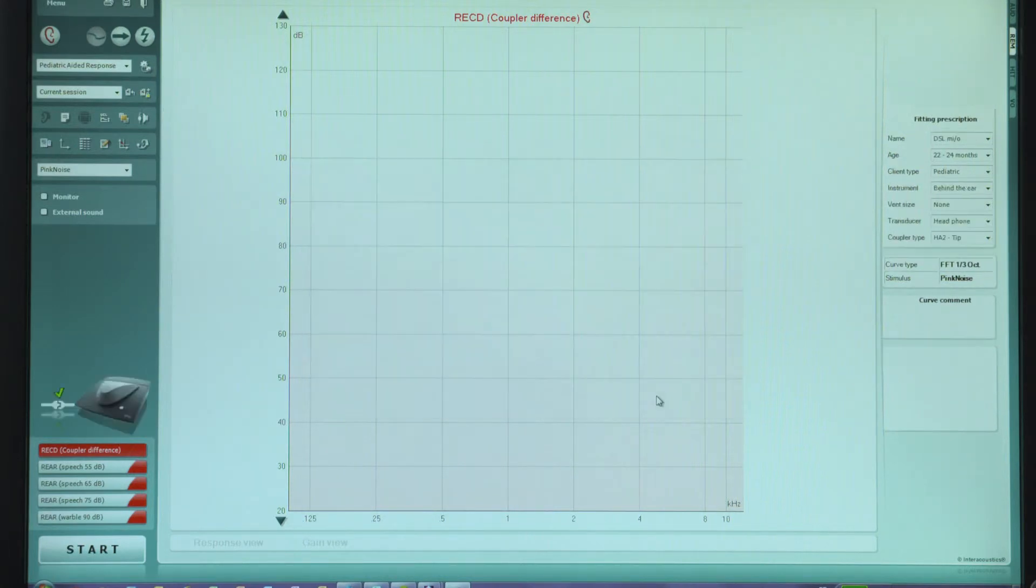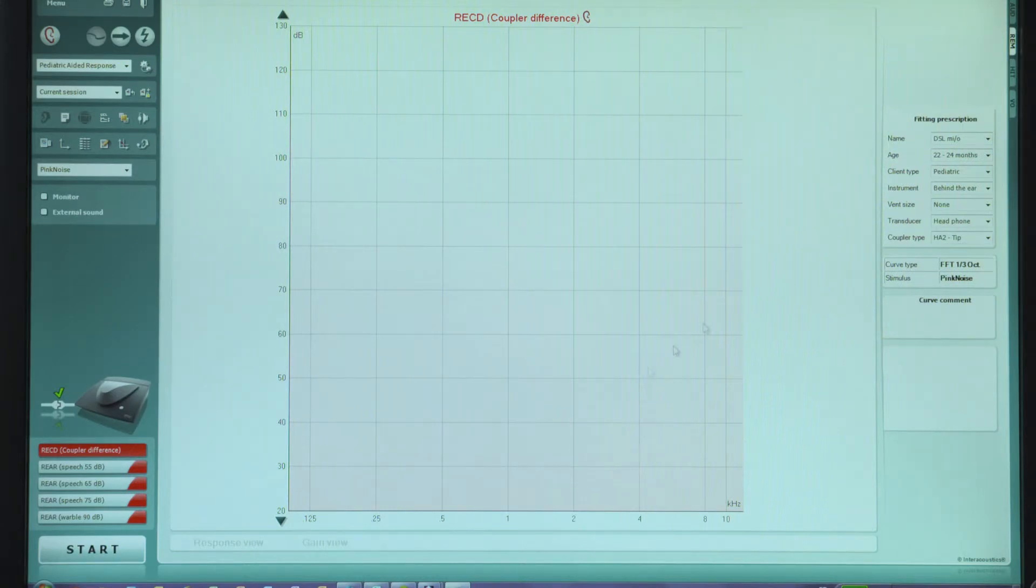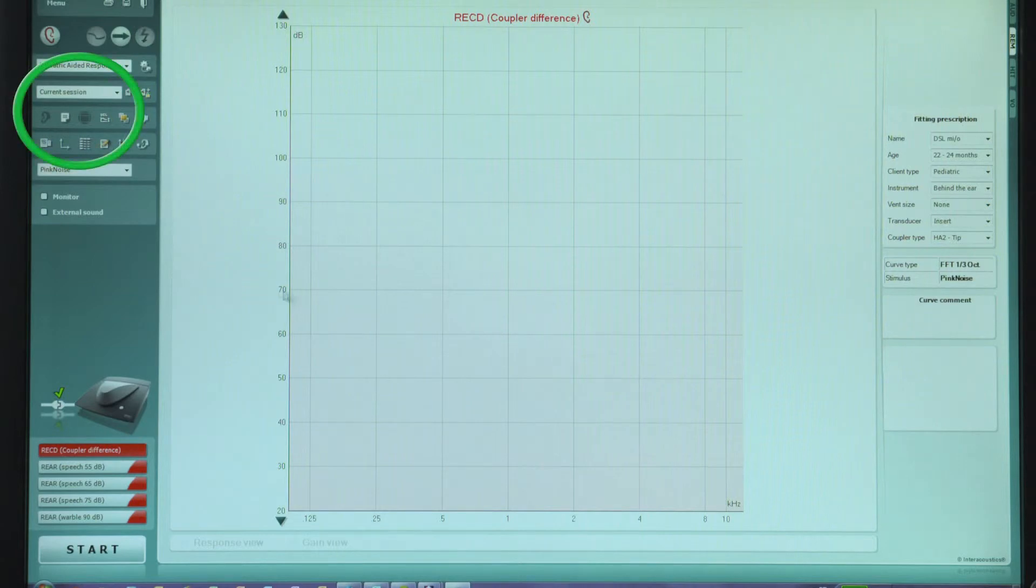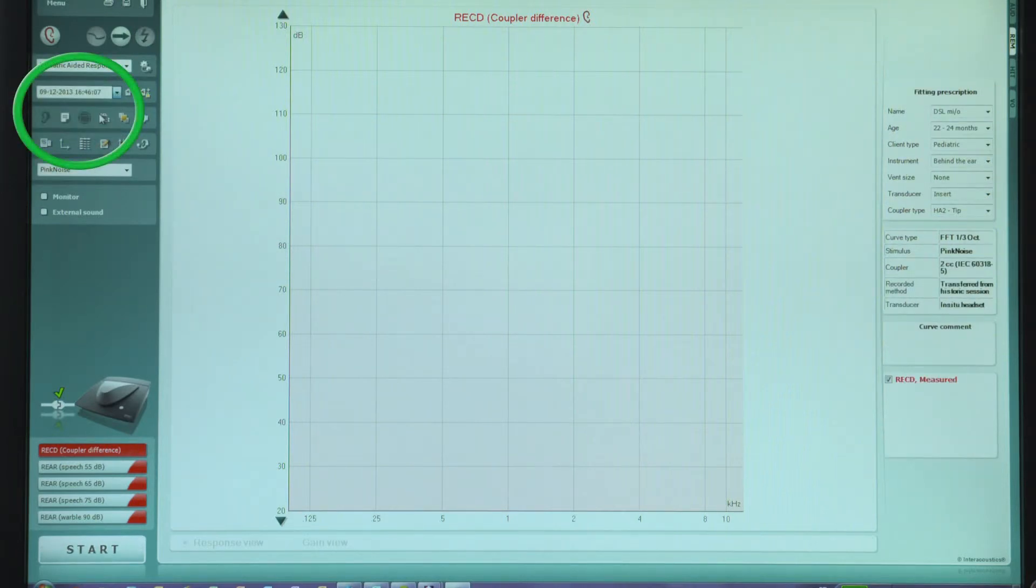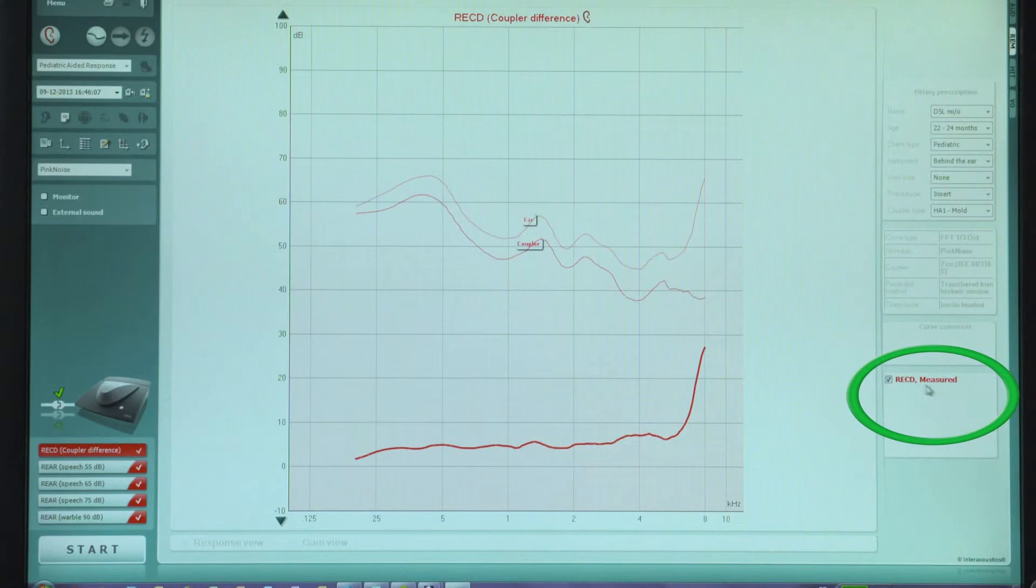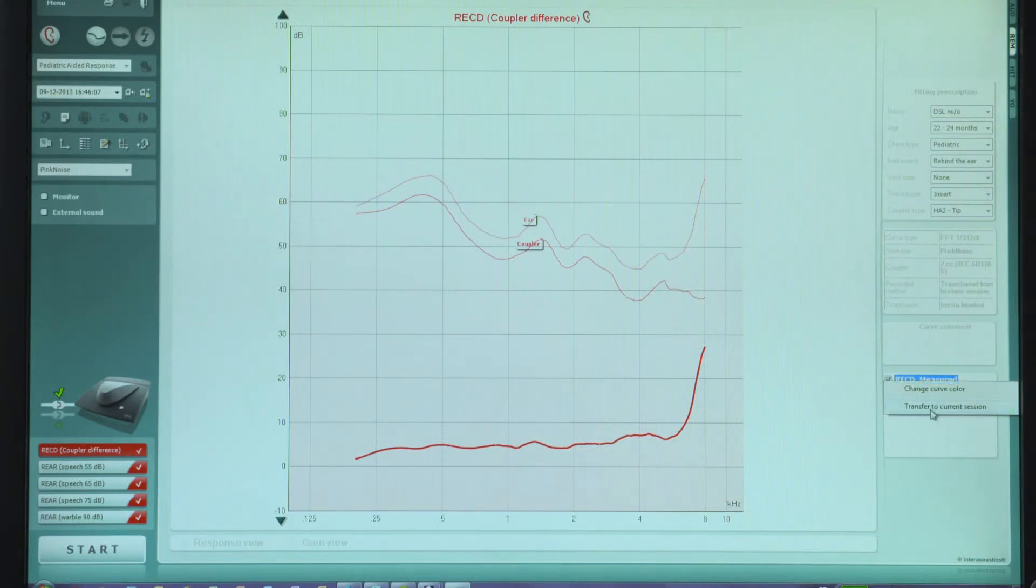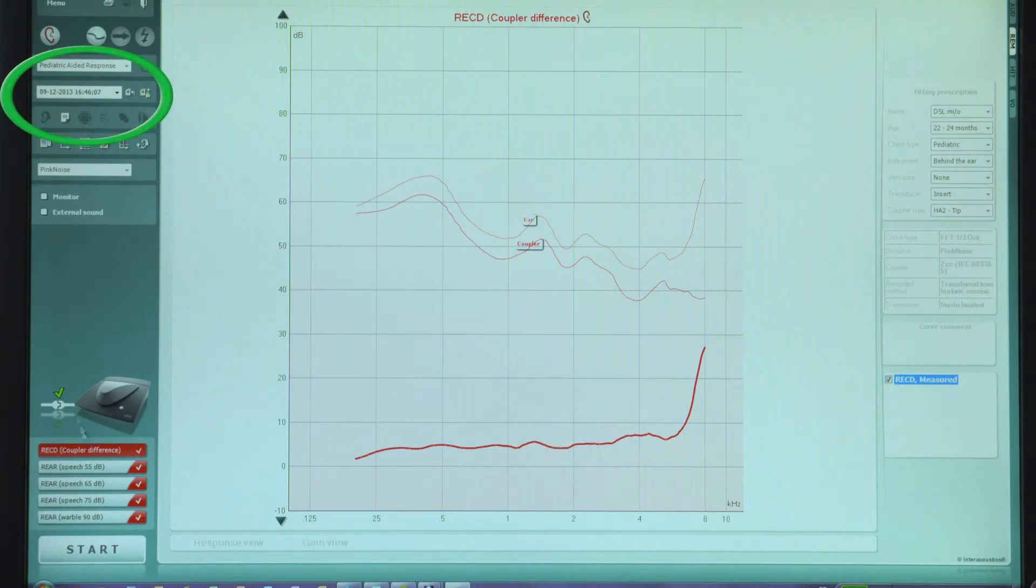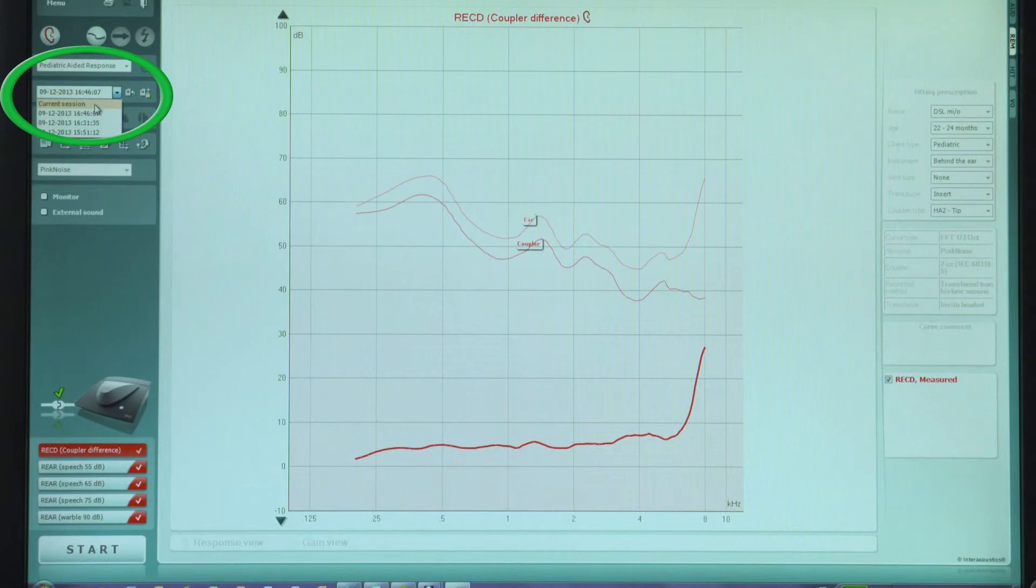The previously measured RECD values needs to be taken into account during the fitting. To do this, select a historical session from the drop-down list when the RECD was measured. On the right-hand side of the screen, right-click on RECD measured and then select Transfer to Current Session. Go back to the current session. The RECD values will now be available in the active REM session.